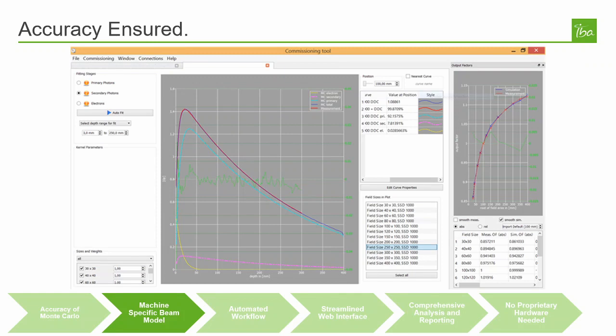The beam models are created with proprietary modeling tools and are customized for your machine. For an accurate beam model, the measurements required are a set of output factors, photon depth doses, and cross-line profiles. In addition to getting a more robust calculation, we will also provide you with the beam data verification audit of the submitted measurements. The beam data quality check is a complimentary service that comes with the purchase of each SciMoCa beam model, but it can also be purchased separately from SciMoCa as well.